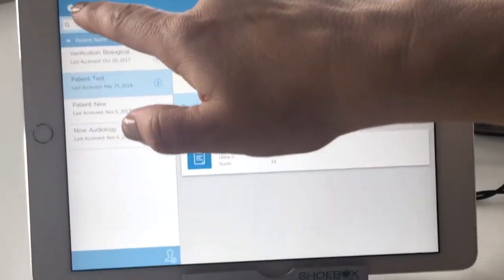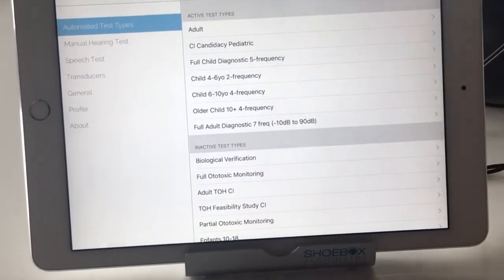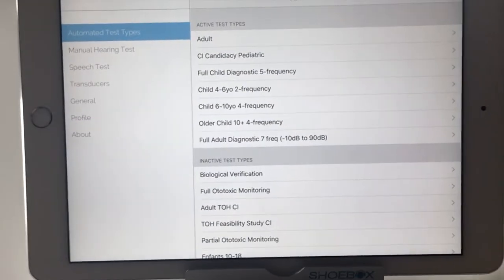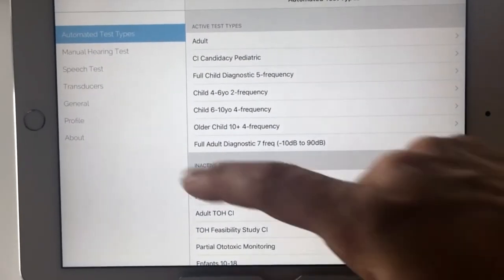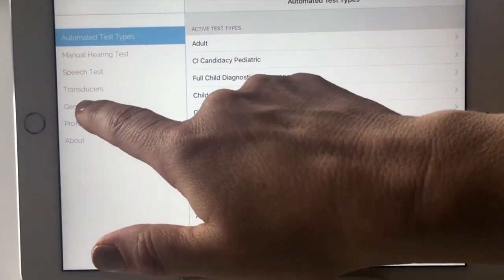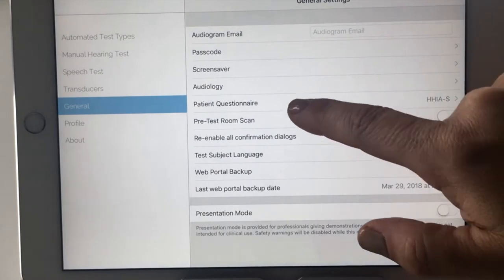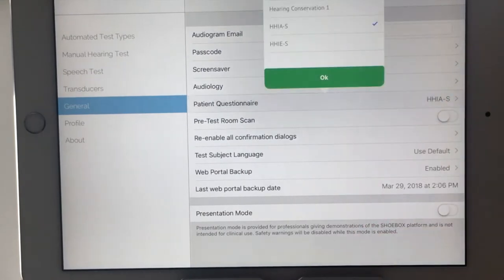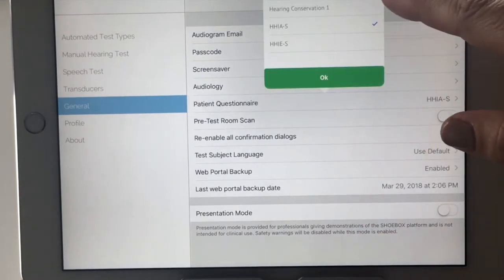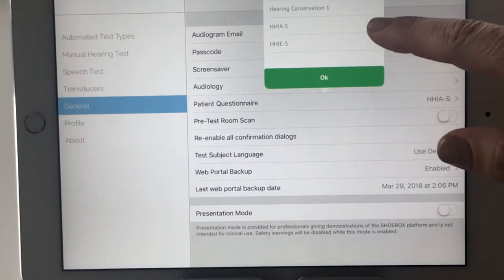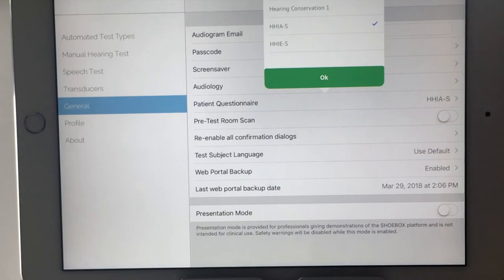In order to select the appropriate questionnaire, you would go into your settings screen, into the general section here, and your patient questionnaire. You'll see here that we have three different types of questionnaires.